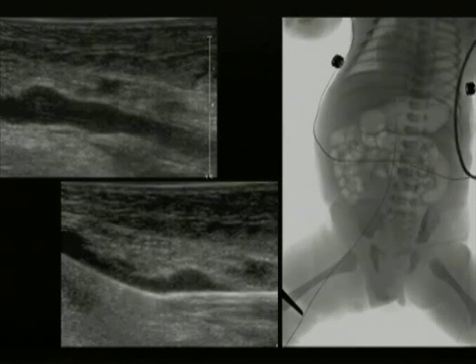In very small children, one maneuver that works out very well, here we have two images of the common femoral vein, the top one prior to access and the bottom one with the needle and the guide wire in place. And the image on the right shows that we are able, in very small children, where the black arrow is the straight arrow, we can make a skin puncture well below the diaper line to decrease the risk of vascular infection and blood-borne infection associated with the vascular access procedure and long-term maintenance of the vascular lines.